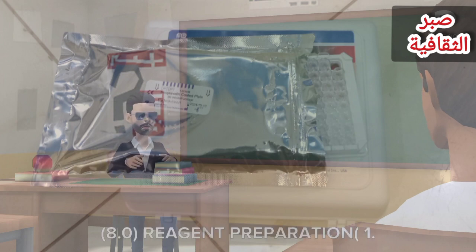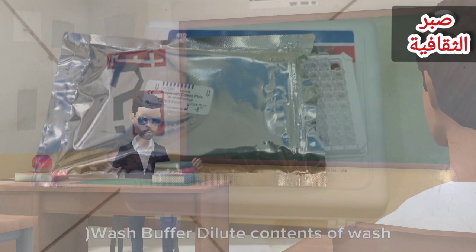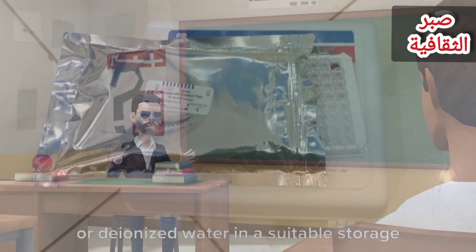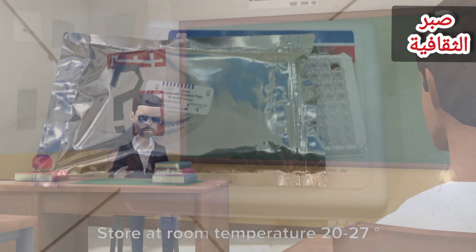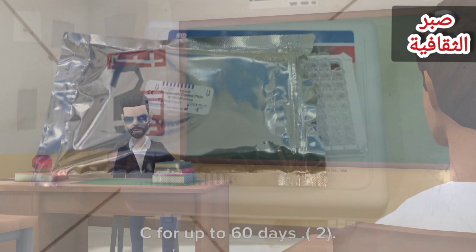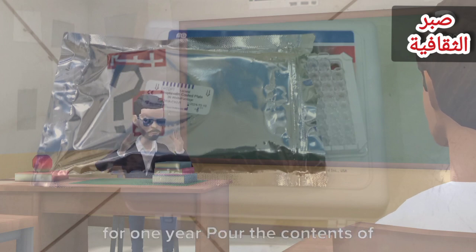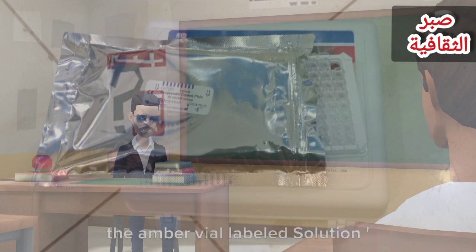8.0 Reagent preparation. 1. Wash buffer. Dilute contents of wash concentrate to 1000 milliliters with distilled or deionized water in a suitable storage container. Store at room temperature 20-27 degrees C for up to 60 days. 2. Working substrate solution, stable for 1 year.